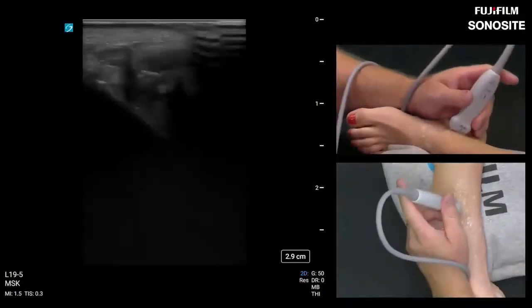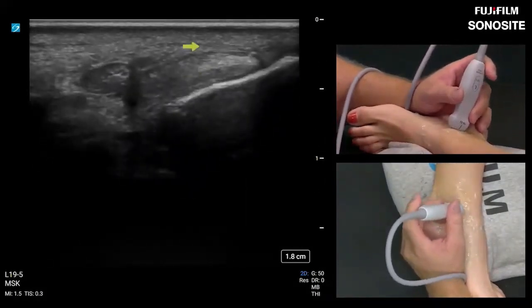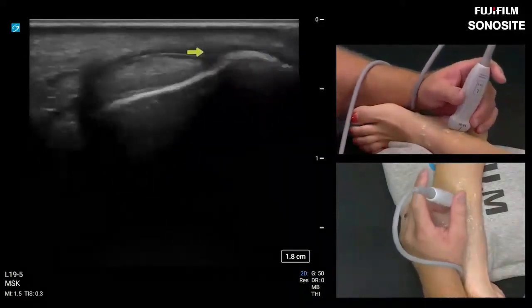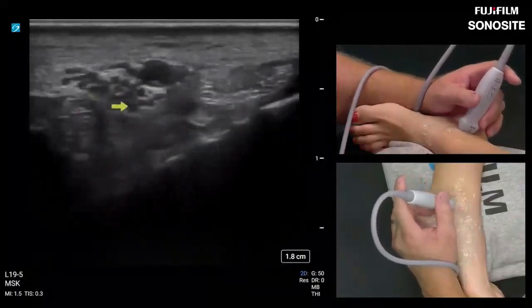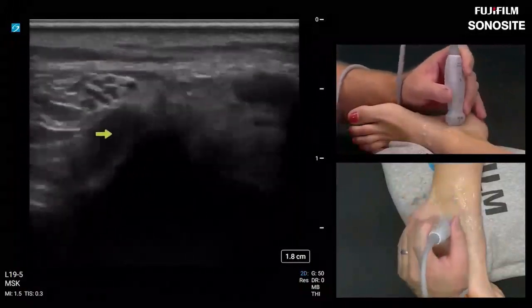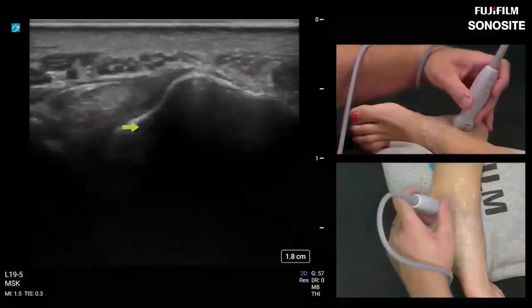Of the tibialis posterior. So here's tibialis posterior, bring up my depth, grab my arrow back, much higher resolution. We can actually see the flexor retinaculum, which will be covered in the tarsal tunnel. But flexor retinaculum, tibialis posterior, flexor digitorum longus, neurovascular structures, which we'll chase down later. And then here's the FHL, just posterior to that sustentaculum tali of the calcaneus.